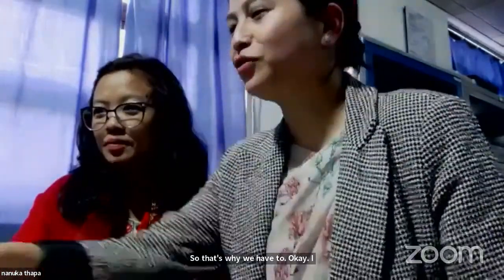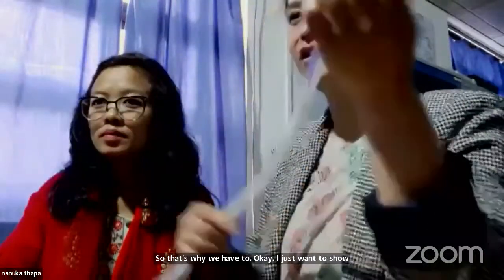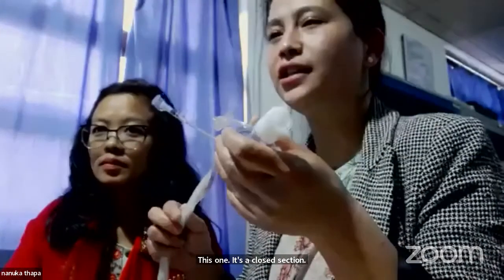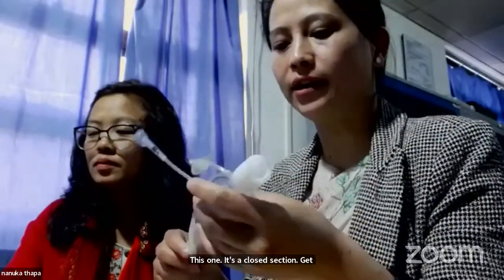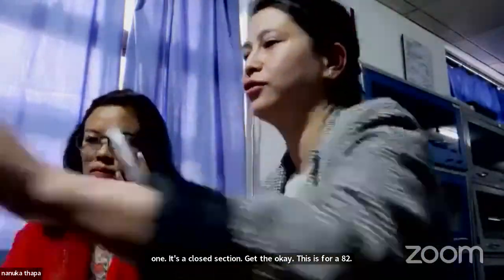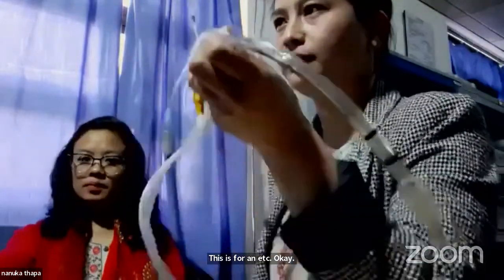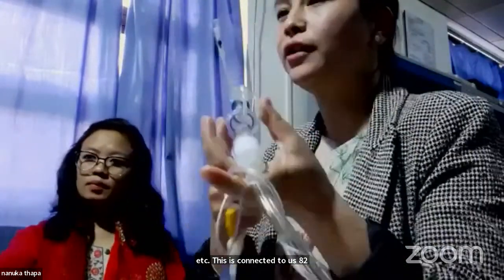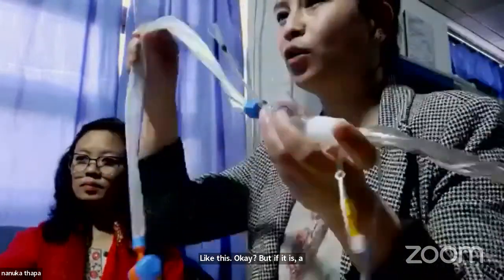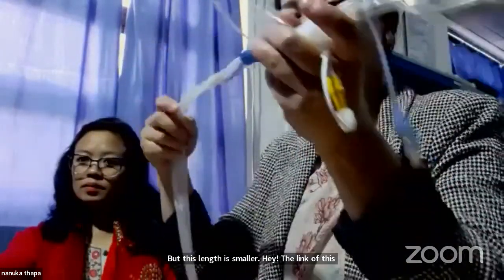Okay, I just want to show this one. This one is a closed suction catheter. This is for an ET tube, so it is connected to an ET tube like this, okay? But if it is a tracheostomy tube, we can also use a closed suction, but the length of this suction catheter will be smaller.